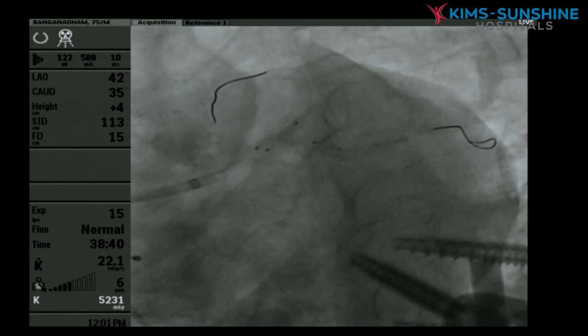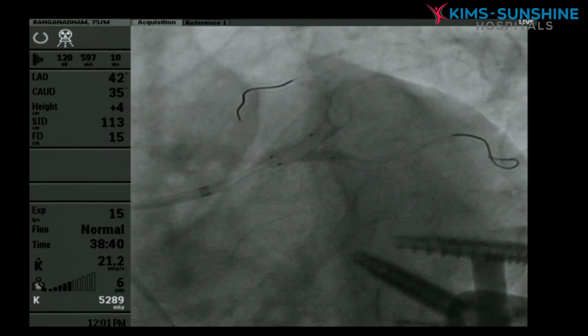You do it. You 14-15 deflate, but that's enough.